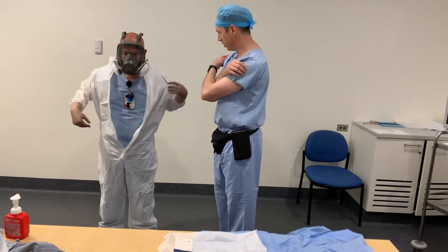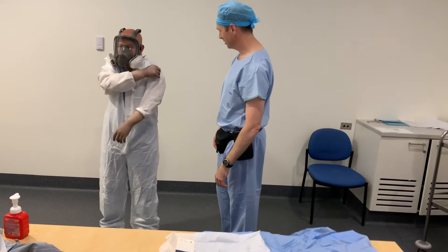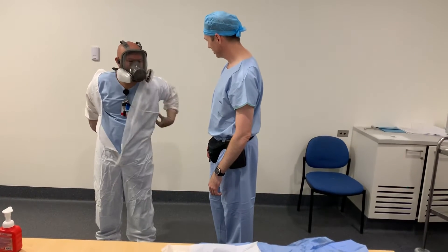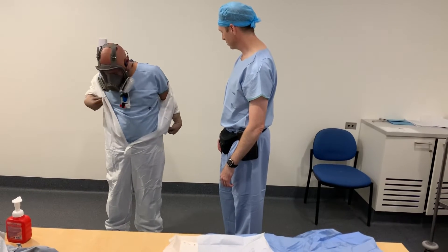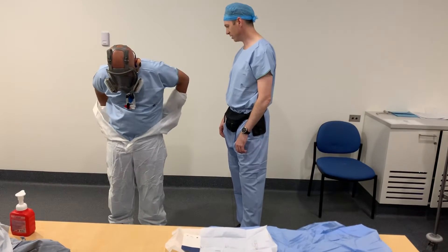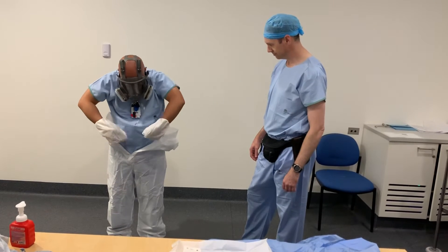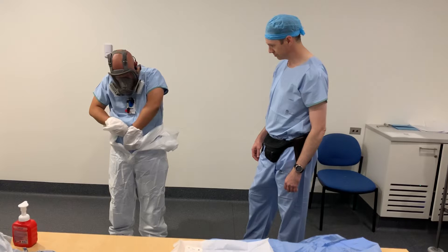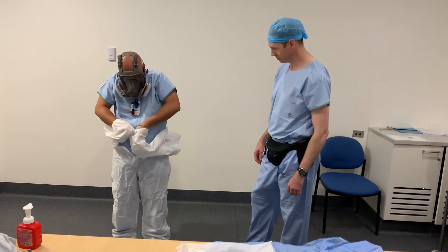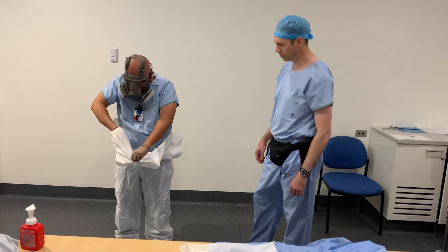It might be easier if you grab opposing shoulders. It can be tricky — just take your time and do it slowly. Peel it off — the gloves will come off with it. You can remove the gloves after if you have to. I taped them before, which is probably why they came off more easily.